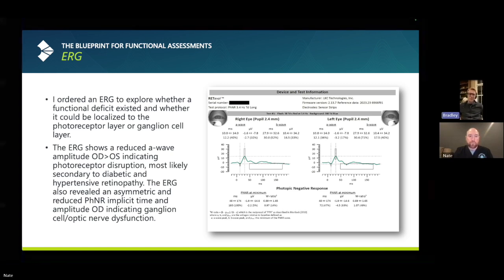Yeah, I don't think the lowest we've done is 12, like a type 1 diabetic that we just want to get a baseline so that we can track the DR score and watch for progression over time. But most of the bread and butter is not in pediatric patients, but it does have its use for seeing if there's truly a retinal pathology for a healthy looking or generally healthy looking retina, but 20/50, 20/60 vision that you can't fix.